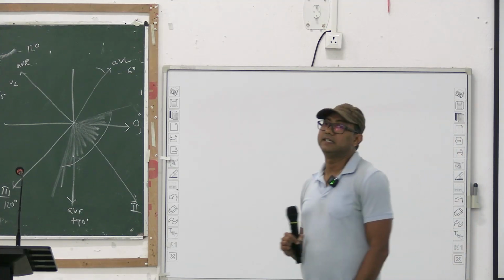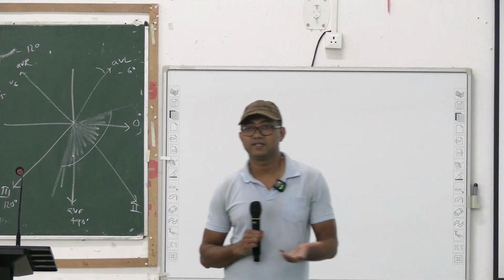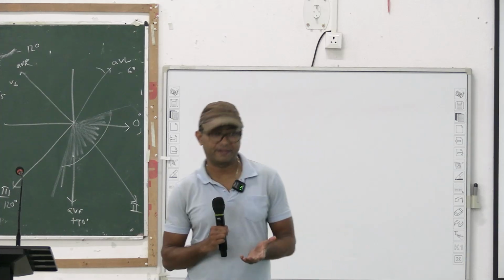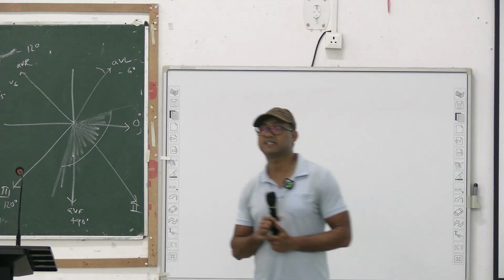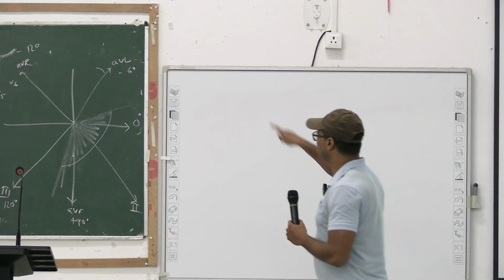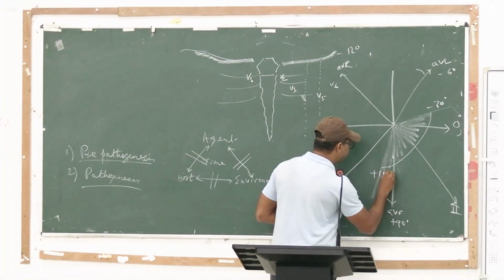Yes, it is the combination of all the vectors. It is the combination of all ventricular vectors particularly. It is the combination or the resultant of all the ventricular vectors, right. This is ECG axis, and in a normal healthy individual, it must be within this range, minus 30 degree to plus 110 degree.